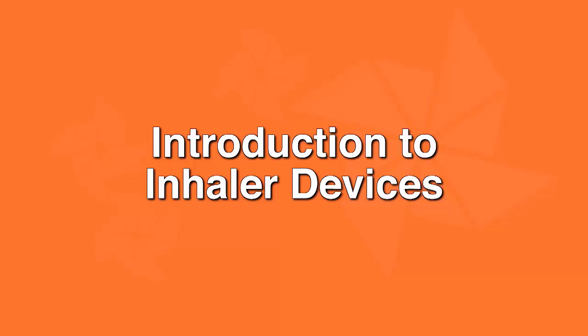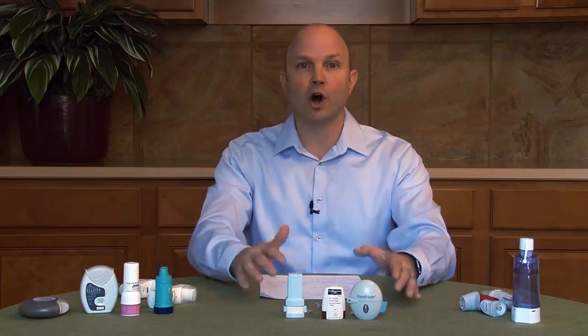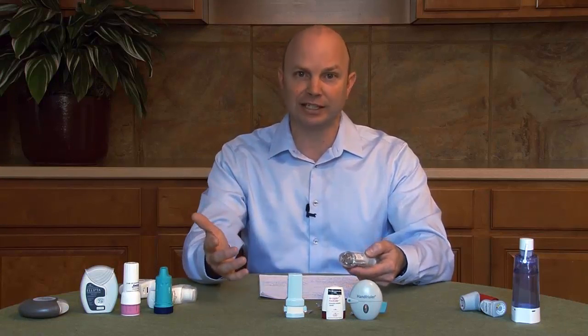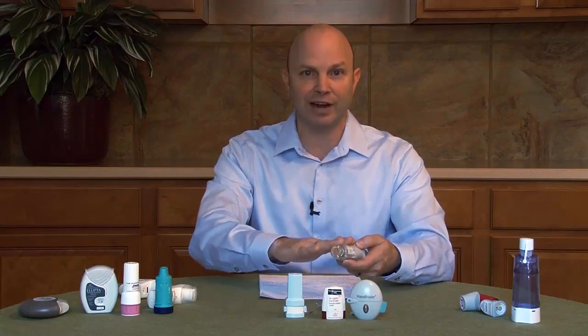This is an introduction to inhaler devices. Just like your medications, there's a lot of different ones available, and there's almost as many different devices as there are medications. But you will notice that a few devices are used for multiple medications, so make sure you refer to your medication list to see what medicines go into each of these inhaler devices.